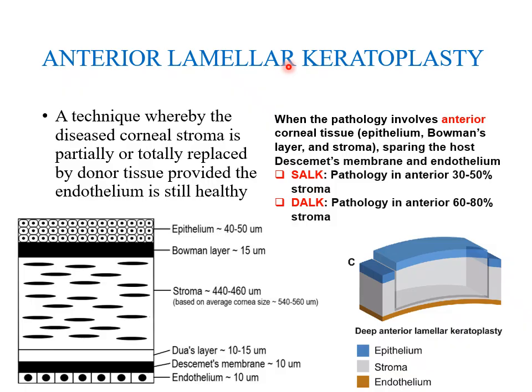This lecture is mostly about deep anterior lamellar keratoplasty, because it is the most popular anterior lamellar keratoplasty. Bowman layer transplant and superficial anterior lamellar keratoplasties are not that widespread. So we'll be talking about DALK, or deep anterior lamellar keratoplasty.